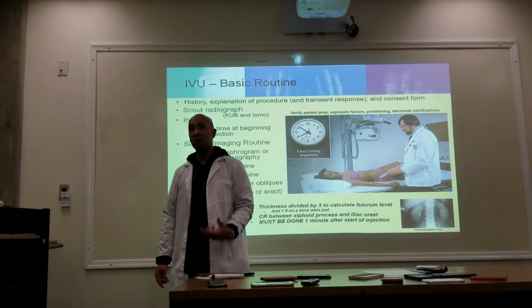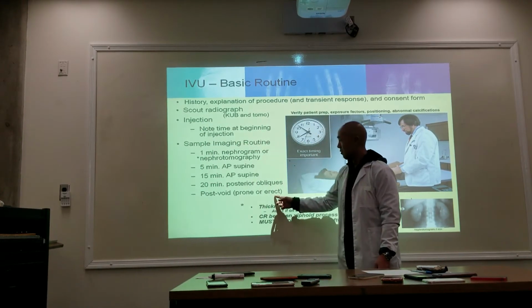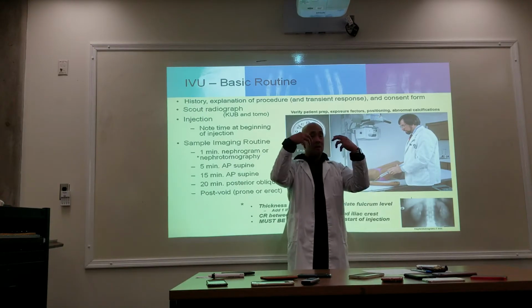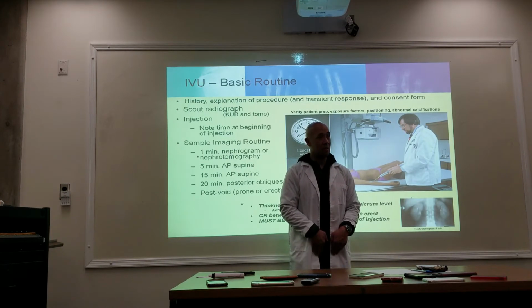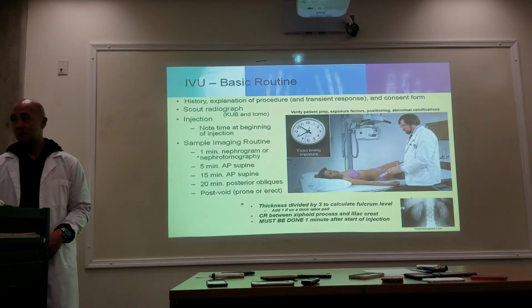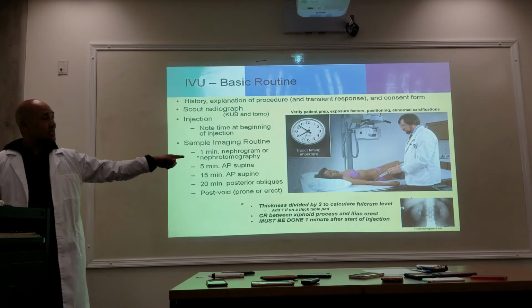Most places that I've worked, we did an upright post-void. Because what we're looking at now is the bladder in an upright position to see if it's prolapsed past the pelvic region, the symphysis pubis. We're going to talk a little bit more about this in just a minute, but that's the routine.